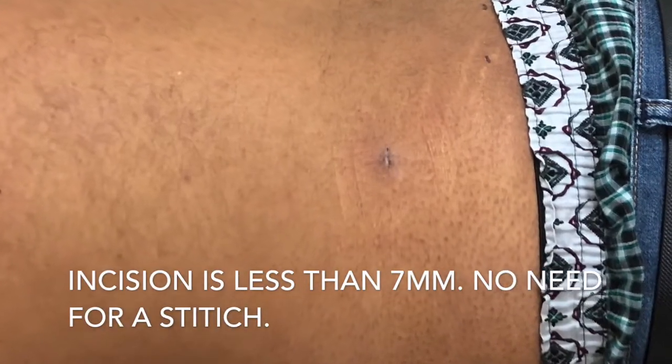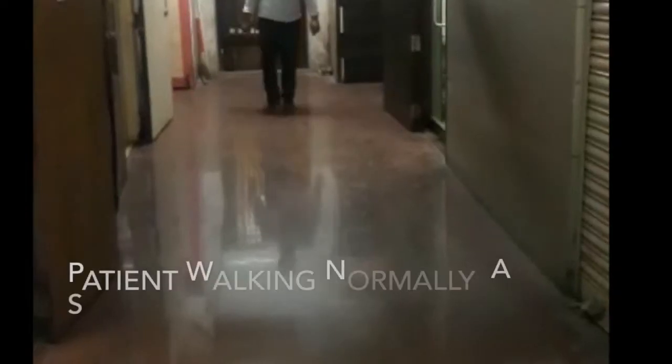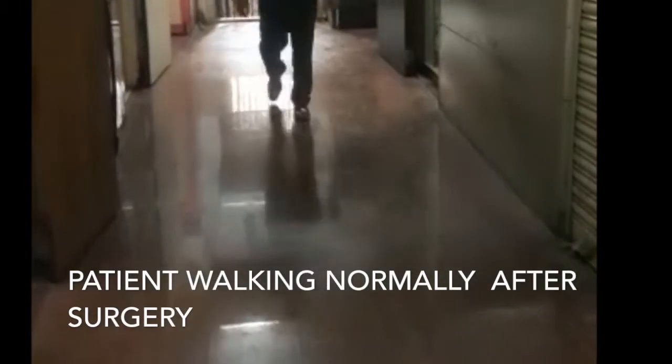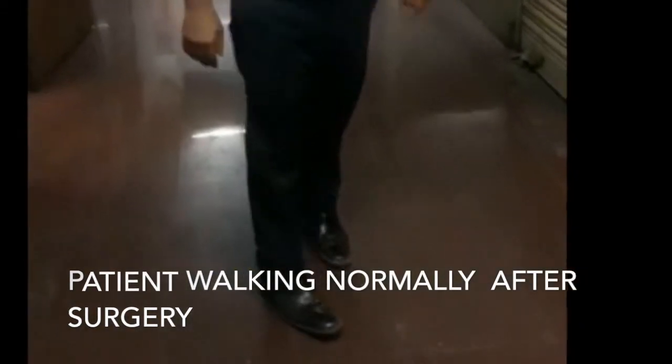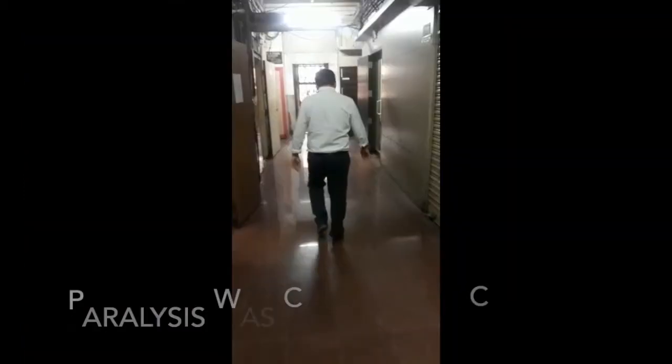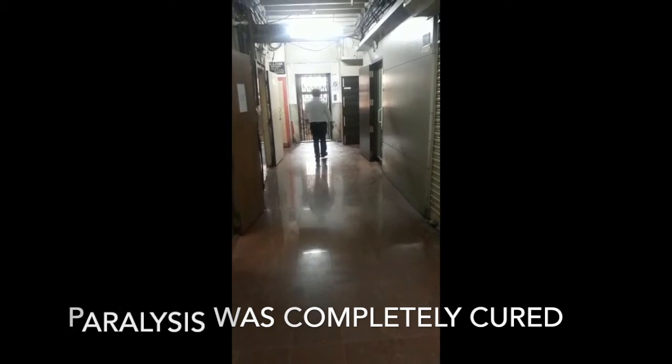The incision was less than 7 millimeters and no stitch was taken, and the patient was mobilized immediately after surgery. This is the patient walking 1 month post-surgery, and he has recovered completely from his foot drop with grade 5 power in both feet and no complaints of any numbness or loss of sensations.